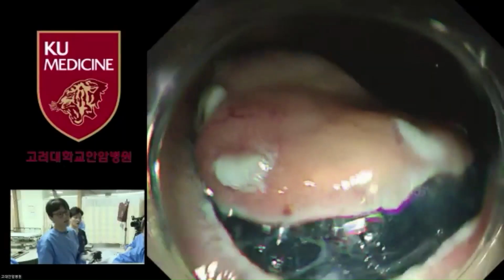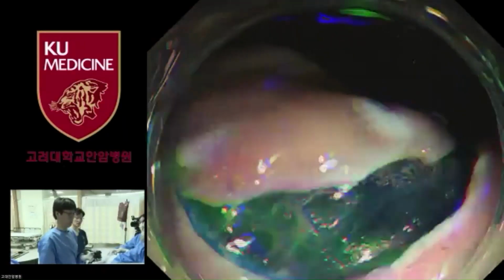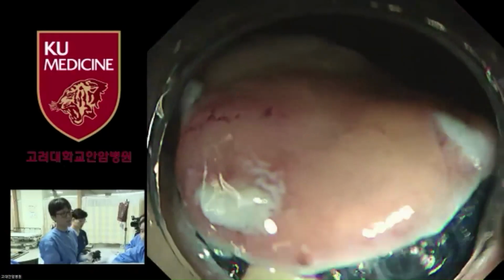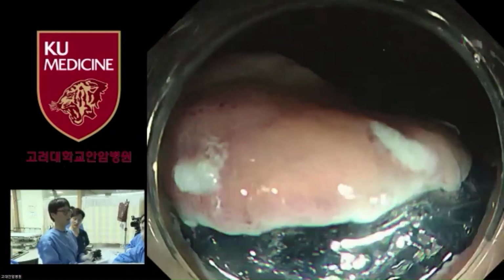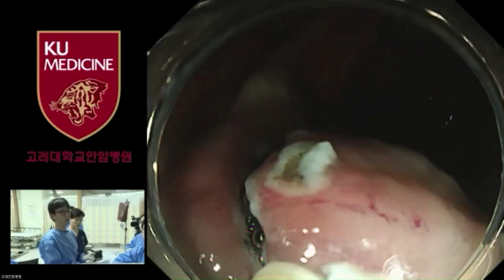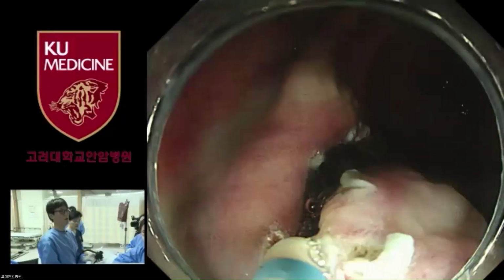Okay, now I have finished the circumferential cutting. Congratulations, very fast. Well done. I start to trim to better visualize the submucosal layer in the proximal part. Okay, so do you want to change to the endoscope equipped with a robotic device now? After finishing the trimming, I will exchange my endoscope with the robotic system. Okay, just a few minutes later he will change the scope to the one equipped with the robotic-assisted device.